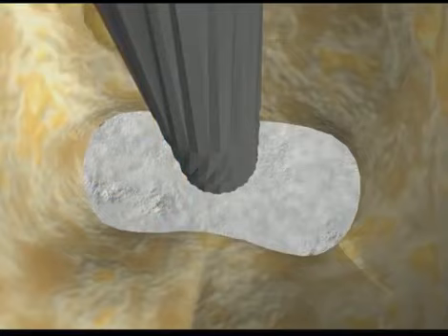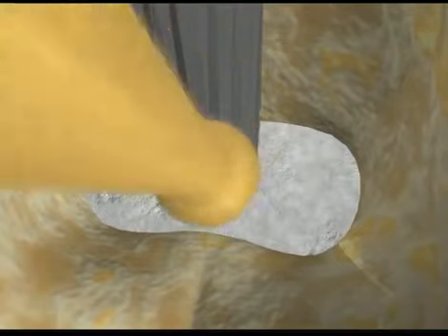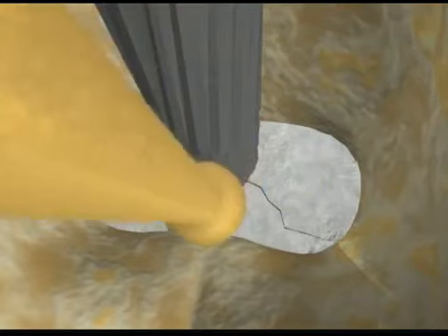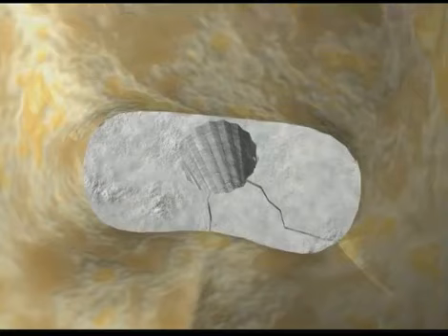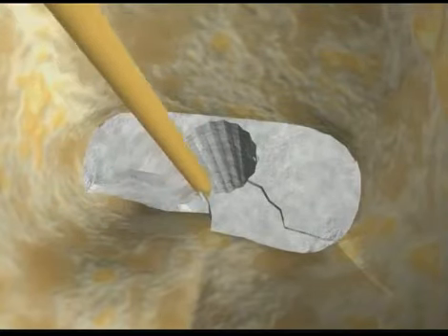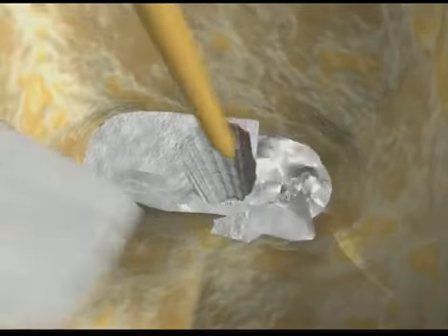We are now looking at the occlusal view. The energized Endo 1 tip continues to vibrate against the post. We can now observe fracture lines in the cement and the initiation of post bond failure. Following post removal, an appropriately sized ultrasonic instrument may be utilized to remove circumferential restorative materials.